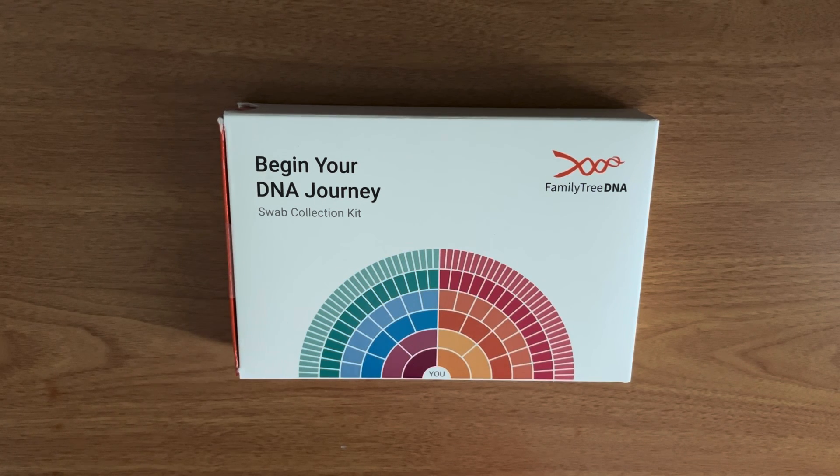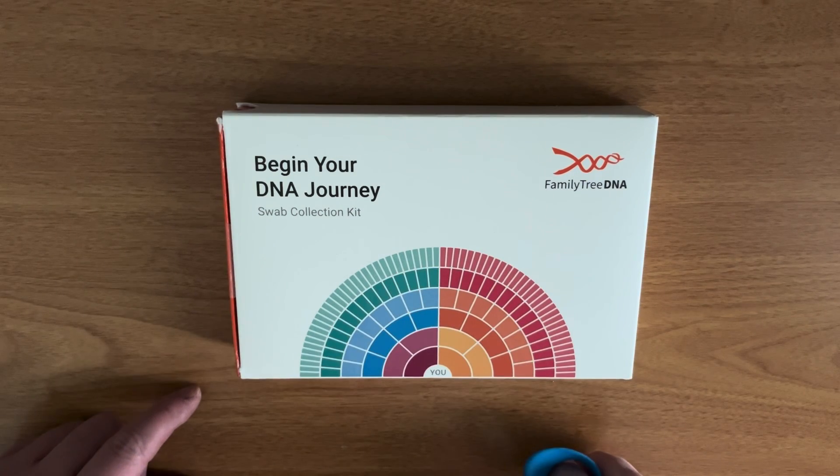Hi, I'm Dr. Joe Ross. I'm a geneticist and I'm doing this unboxing video — the most nerdy unboxing video ever — a Family Tree DNA testing kit.